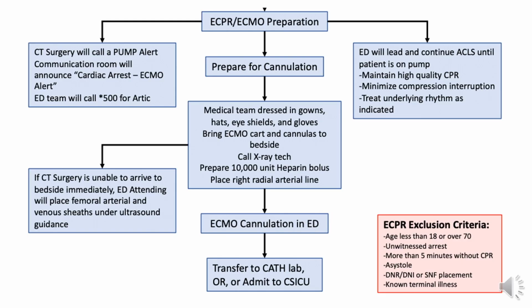But if they are a great candidate or a good candidate, then preparation will begin even before the patient arrives. A pump alert will be called. This is going to bring the team downstairs. The emergency department is going to take over for you guys, and our job is to continue ACLS while the CT surgery folks handle the middle column here. If for whatever reason CT surgery is in the operating room, then the emergency department will start placing those lines, not the ones that you guys see, but smaller ones that can be upgraded. This is also something else that we're moving to the point that we hope in the near future some of our emergency physicians will be doing the actual ECMO cannulations.